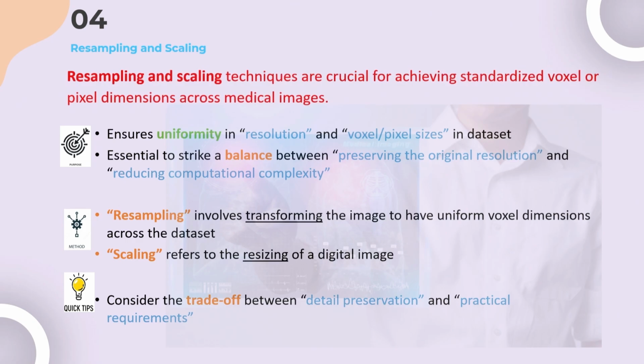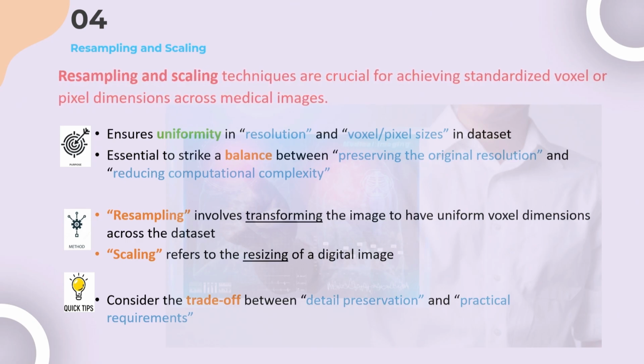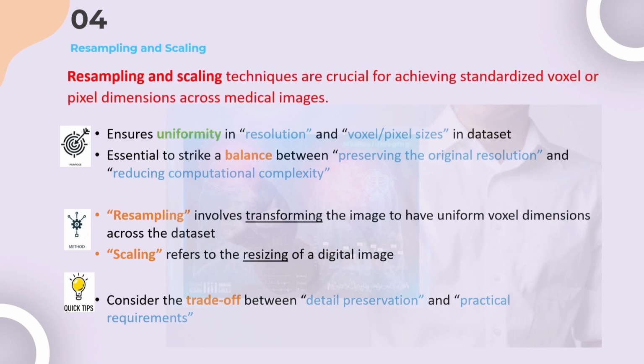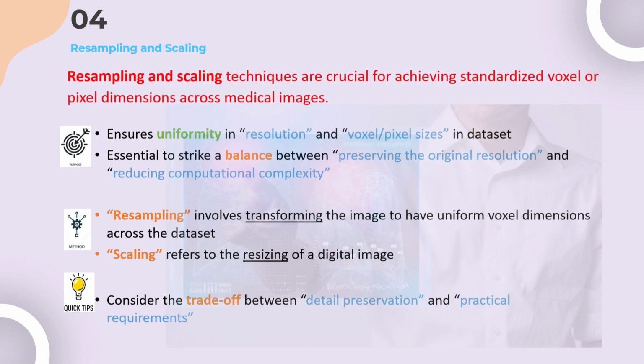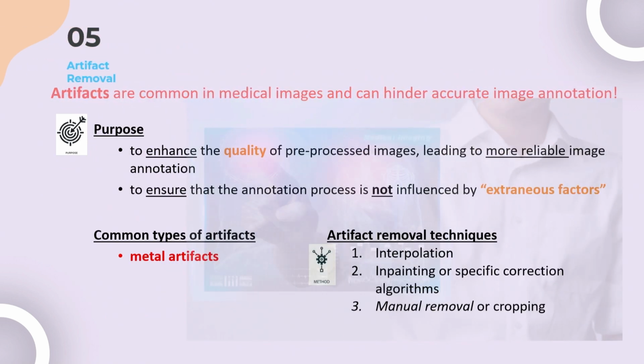And of course, different pixel sizes mean different voxel sizes. So that's why when we do the measurements, we may have to do the resampling or rescaling.